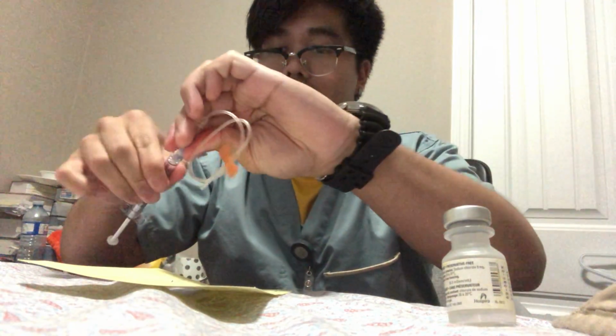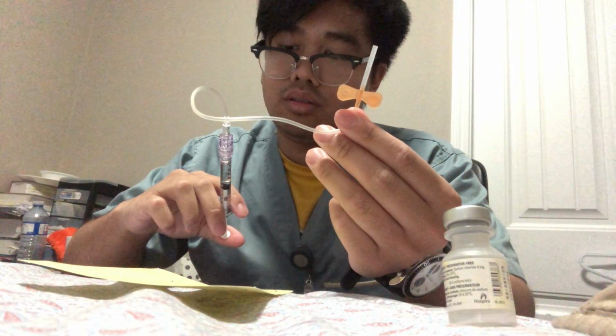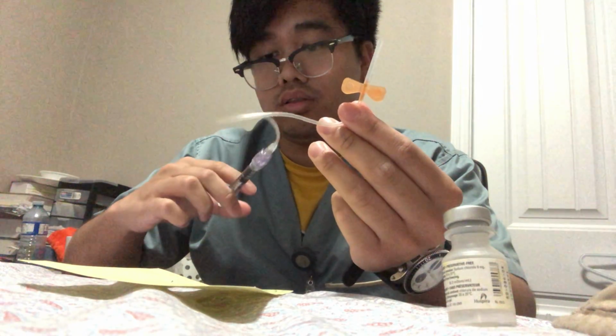So here I'm gonna do the scoop technique. I'm gonna twist this cup off, and then we won't be needing this blunt needle, so we're gonna twist it off and remove it, put it here, and we're gonna put this on, then we're gonna put this and connect it to the neutral connector. Okay, and then as I do that, I'm gonna prime it to 0.54. So I got 0.54 here.